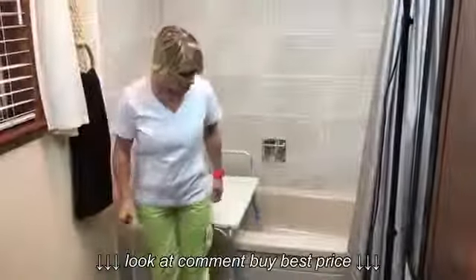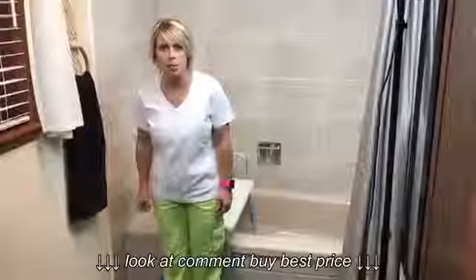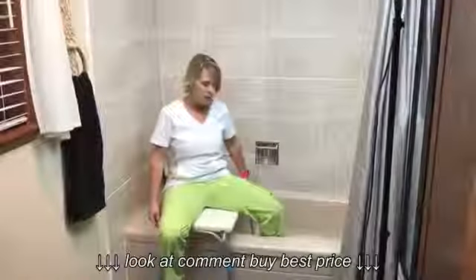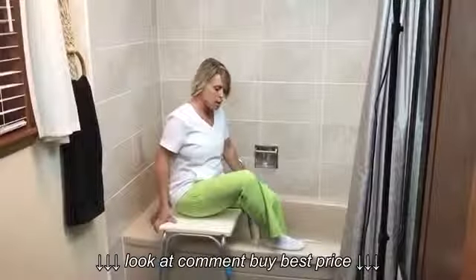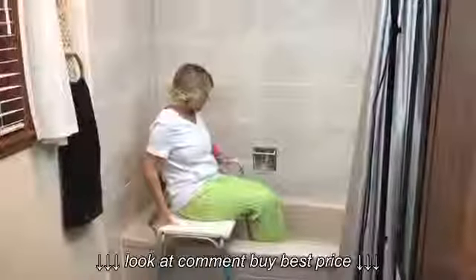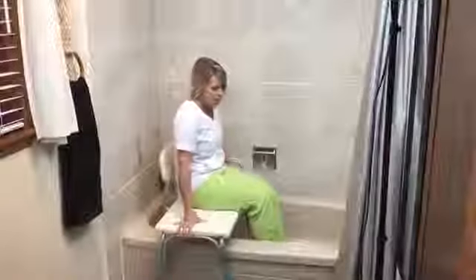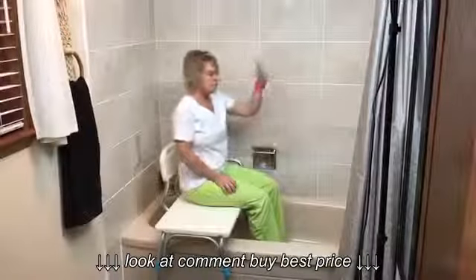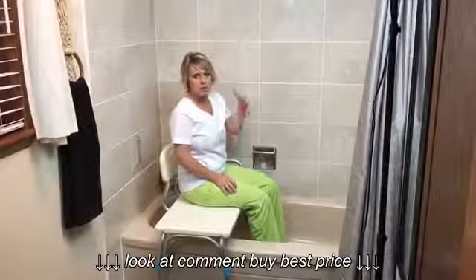We're going to back ourselves up until our legs hit the bench and have a seat. Then I'm going to take my one leg up — I can stop here or go all the way in — and bring my other leg up to the side of the tub or bring it all the way in. Once I'm at this point, I can grab the handle and slide myself in, then grab my shower wand and do my bathing as normal.